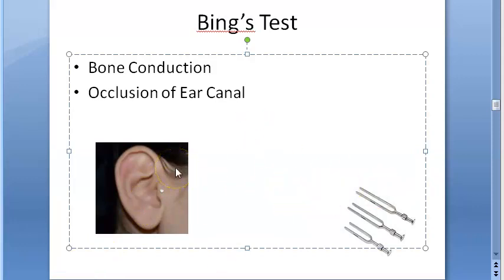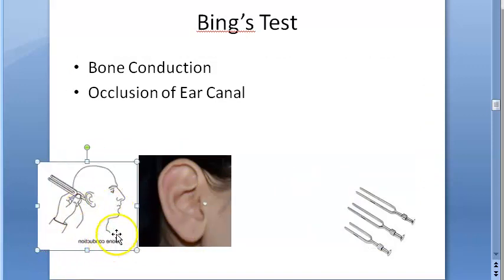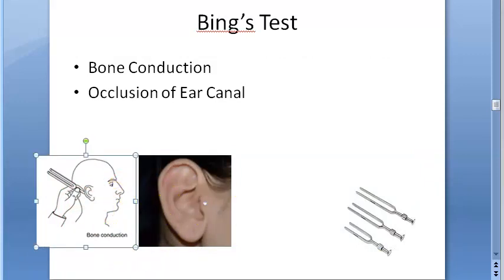You take a vibrating tuning fork and place it on the mastoid. The tuning fork is on the mastoid. Now, with the tragus, they will occlude the ear canal — that means they close the ear canal.